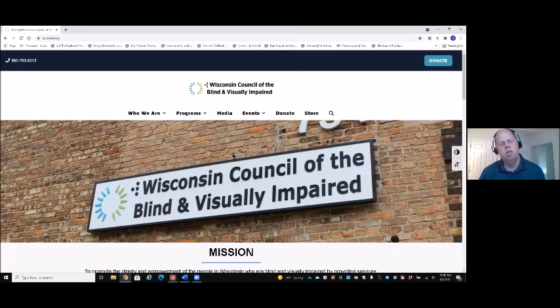Navigation region, list of 7 items. Well, there's a lot of stuff here. If I read it all, it would take me a long time to go through this web page line by line. What I'm going to do is navigate by headings. Headings are major sections of the web page. If the web page author says, hey, this is really important and something you probably want to pay attention to, visually those stand out and draw the eyes to them.